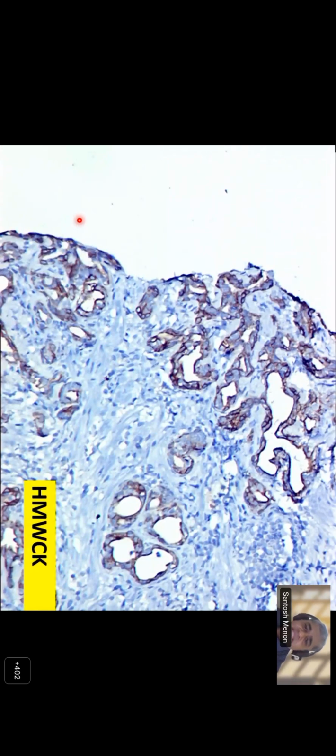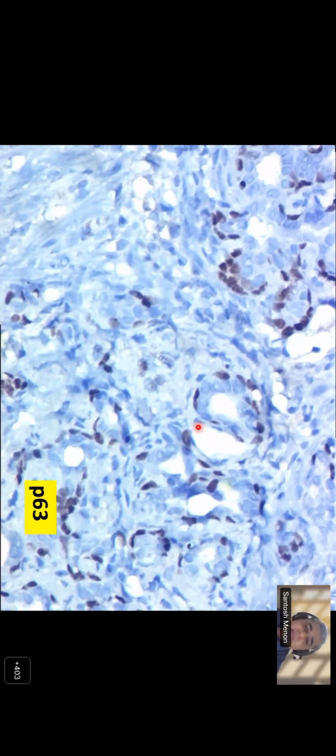So HMWCK is nicely positive, as you can see. P63 was positive in these foci. Mind you, P63 might not be so much. There may be a few cells which are P63 positive, but even a few P63 nuclei in this whole focus would make the whole focus benign, because morphologically they all look similar. So even any presence of basal cells makes the whole focus benign. This is P63 at higher power.